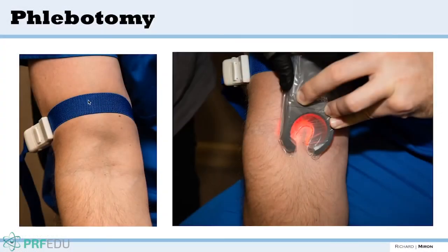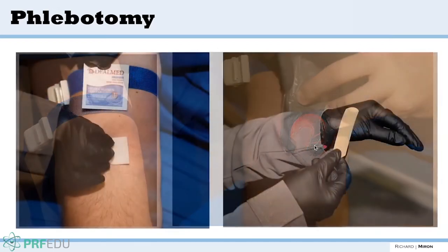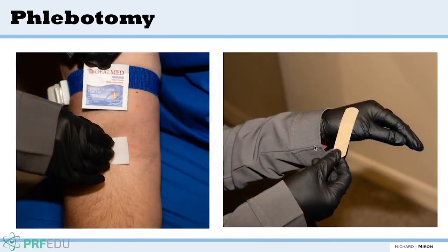Okay, so here's a couple of images. Again, the tourniquet is tied 3 inches above the elbow. And then we're going to use the vein light to locate the vein here. So you can see with the vein light, the vein's located there in the center. Afterwards, we're always going to wipe with alcohol without question, and we're going to wait for that to dry. After that, typically we're going to take a Band-Aid and just put it on our glove. The reason we do this is just to be ready for the blood draw. It just makes the step a little bit easier.